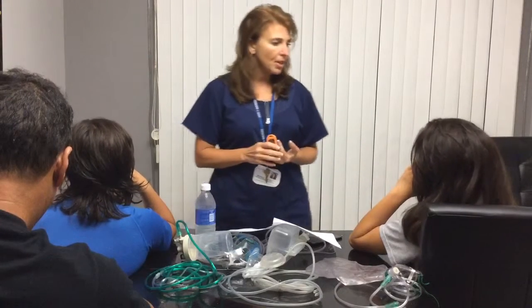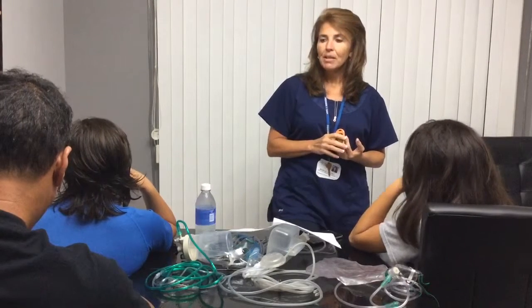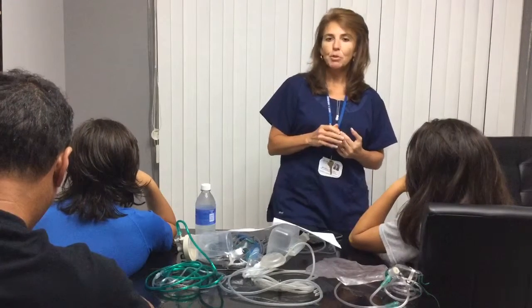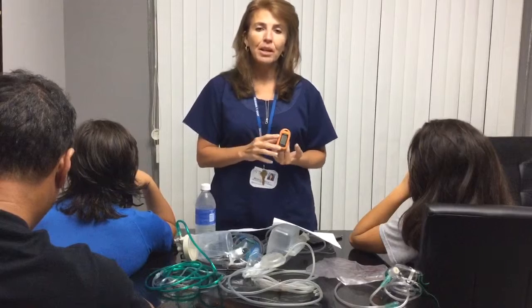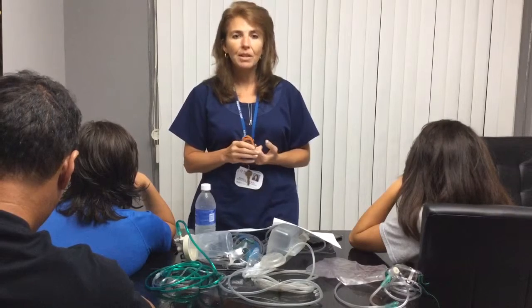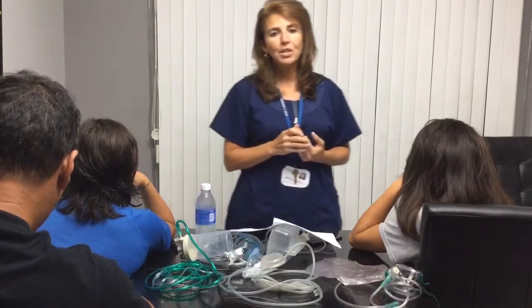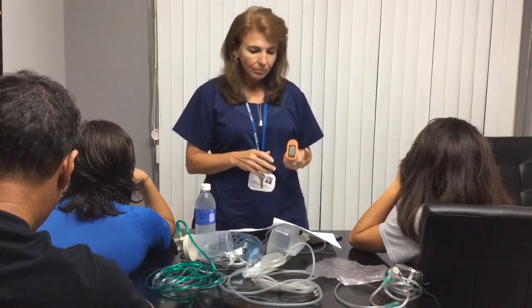All of the documentation is done in our Siemens Net Access, and you can find the latest pulse oximetry readings as well as the protocol and orders for the titration range within Siemens Net Access. Many times patients with COPD will have a lower than physician-specified range, such as 88 to 92, rather than the hospital-wide policy of 92% for adults.